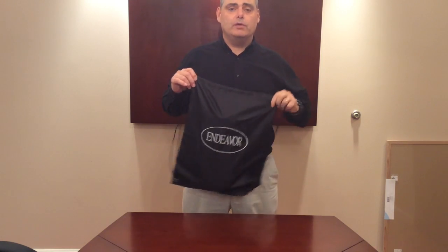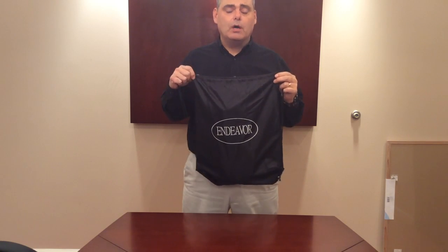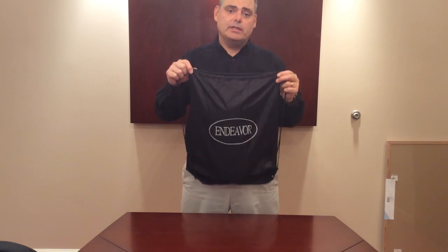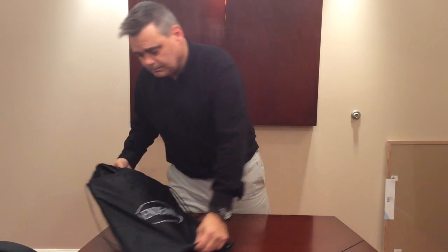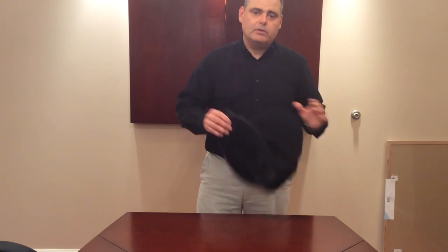I'm Charles Davis with Next Step Medical, here to demonstrate the Endeavor Back Brace fitting instructions. When your back brace arrives it will come in a box in a bag similar to this. Simply remove the back brace from the bag — it will look similar to this.